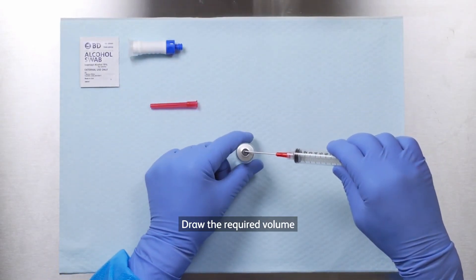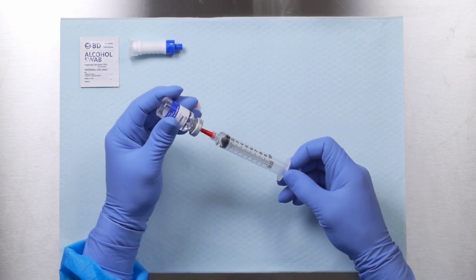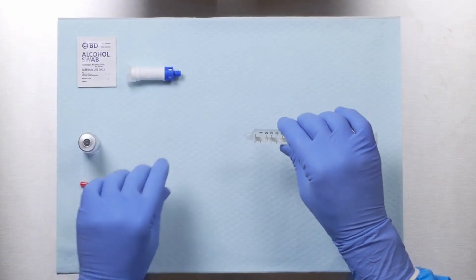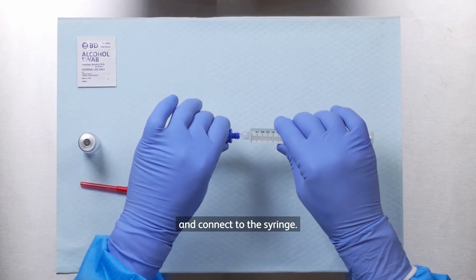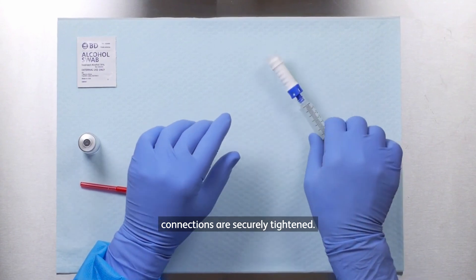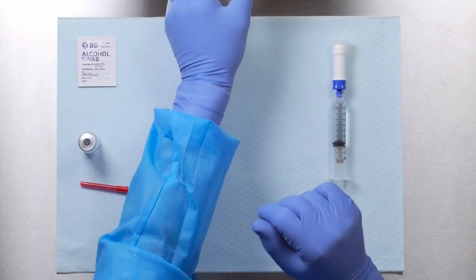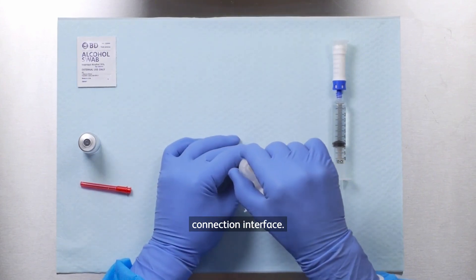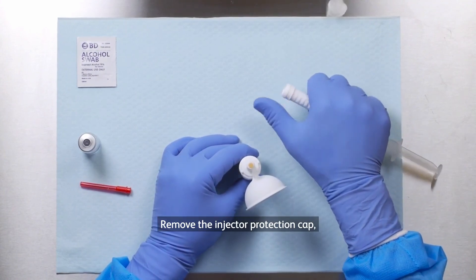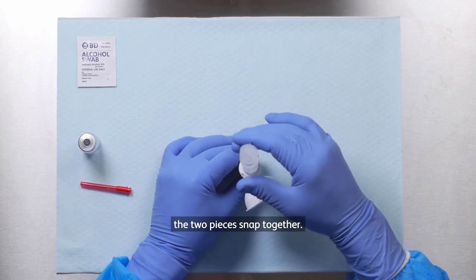Draw the required volume of diluent into the syringe. Hold the blue hub on the injector and connect to the syringe. Ensure all luer lock connections are securely tightened. Remove the cap from the protector connection interface. Remove the injector protection cap, and slide the injector straight onto the connection interface until the two pieces snap together.